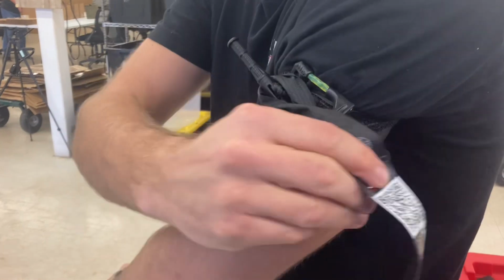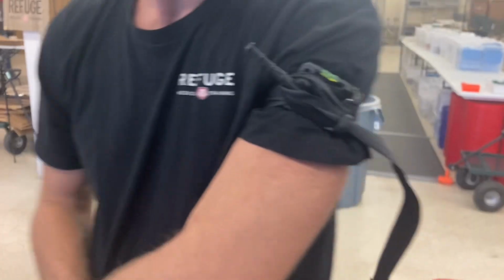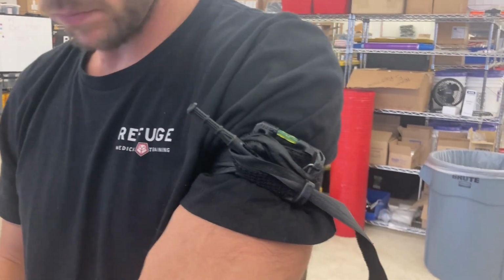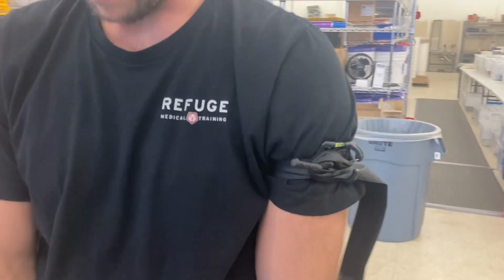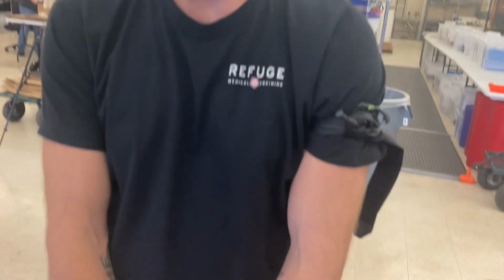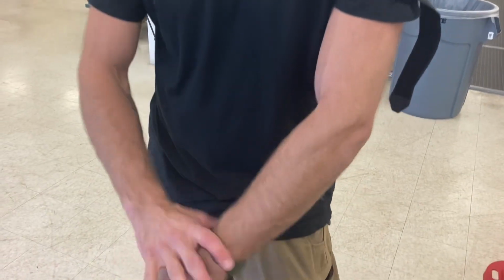Right. I guess I could twist it around. I could do that. That would work. Because the idea is to keep this from getting snagged while in transition or while in movement. Yep. Because if that gets pulled, you immediately lose the effectiveness of the tourniquet. Again, you can see the color changing going on. I mean, it's definitely working. I can feel it. Absolutely.